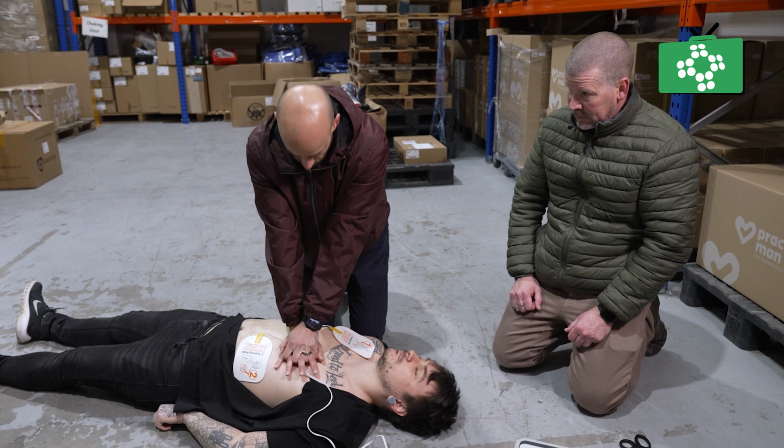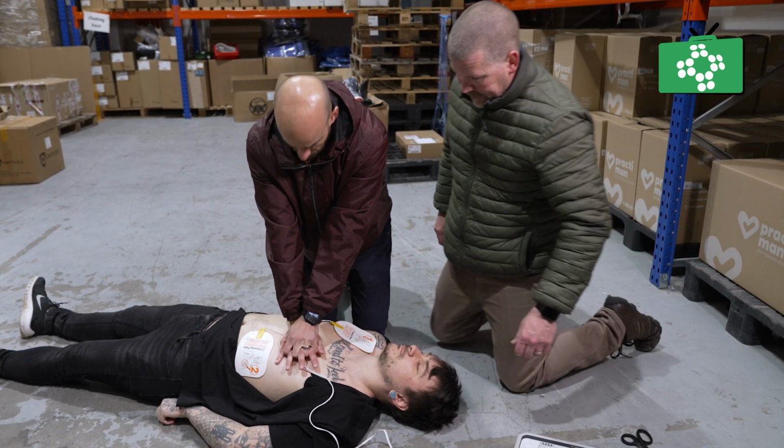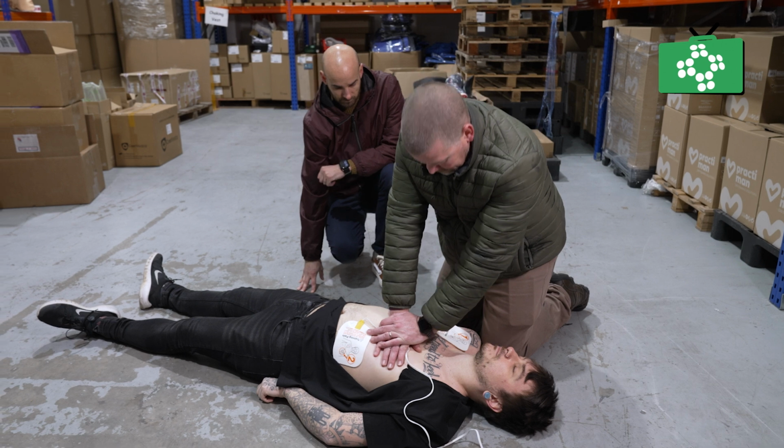If no shock is advised, continue CPR. Keep following the AED prompts until professional medical help arrives or the patient shows signs of life. If working alone, continue until you are physically unable to do so.